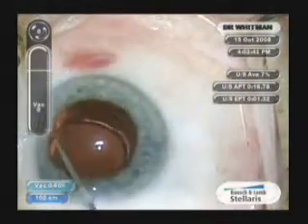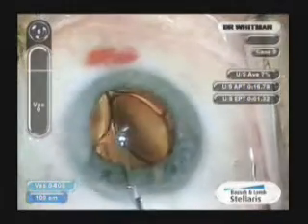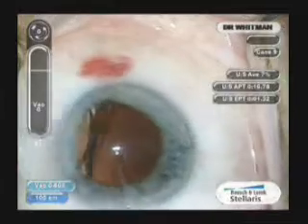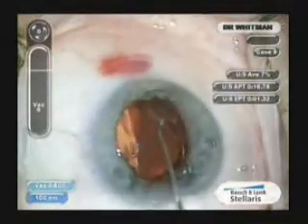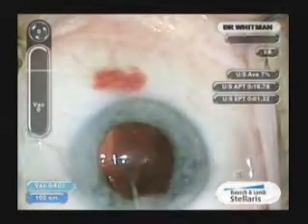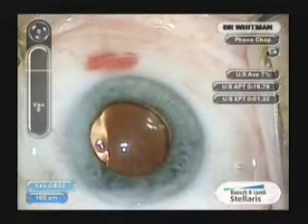All we need to do, because it is such a user-friendly optic and lens implant, is simply turn it over with the second instrument — this happens to be a Conor wand. Simply by pressing centrally on the optic, everything goes back in the bag and centers nicely. Here we go.